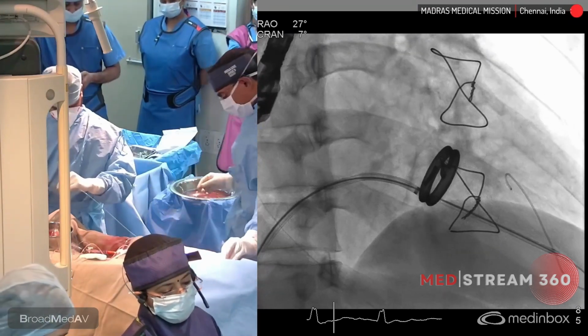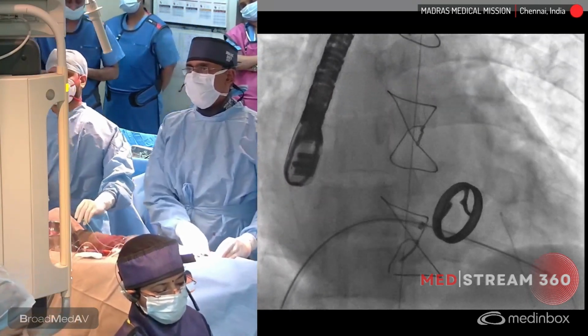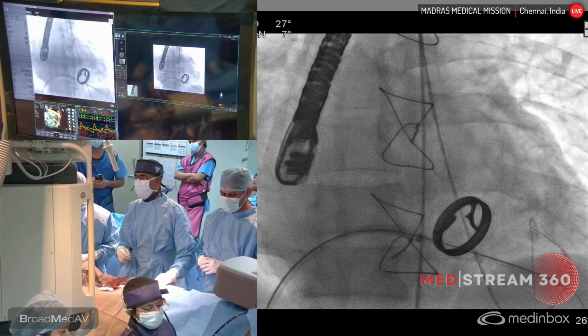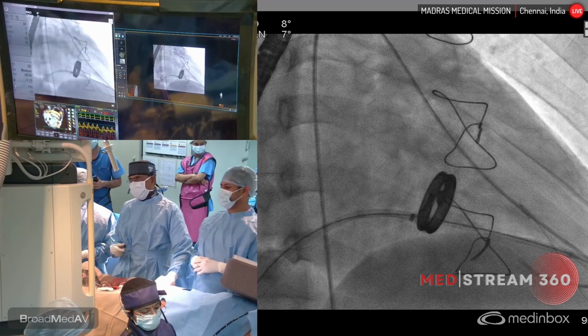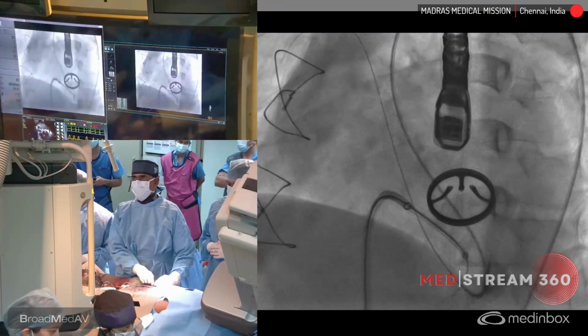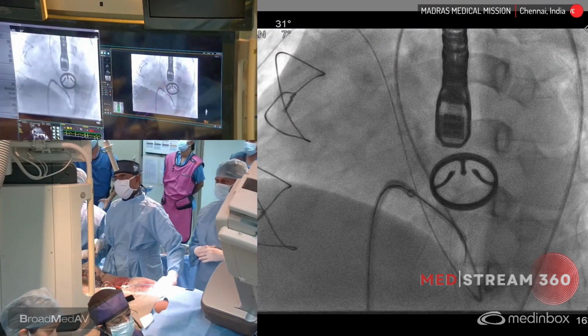We are getting our Judkins left coronary catheter into the ascending aorta. We have entered the ascending aorta. Can you come down to that RAO view? We need to direct the catheter towards the paravalvular leak. So I will now use the LAO projection. At this position, I am trying to cross. I have already crossed the paravalvular leak. Fluoro-store this and demonstrate this again.